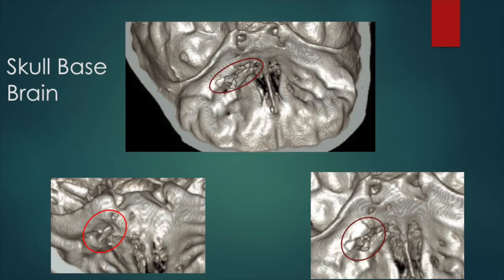And this is from above. That's the anterior cranial fossa. This is the ethmoid sinuses. So it's real close to where I normally work. And then that's the shrapnel coming out. And the carotid artery's right here, dodge that. And it's a fairly safe area if you're going to have a piece of shrapnel go into your skull. So these are just all different views.